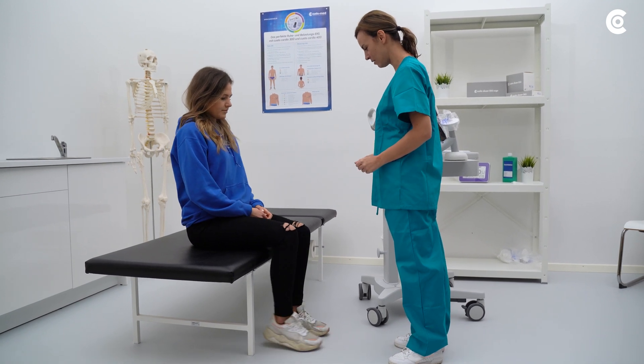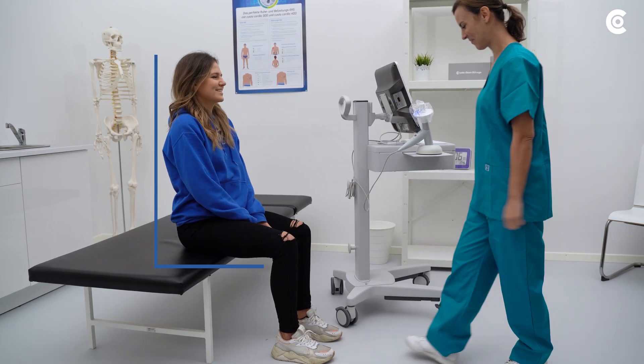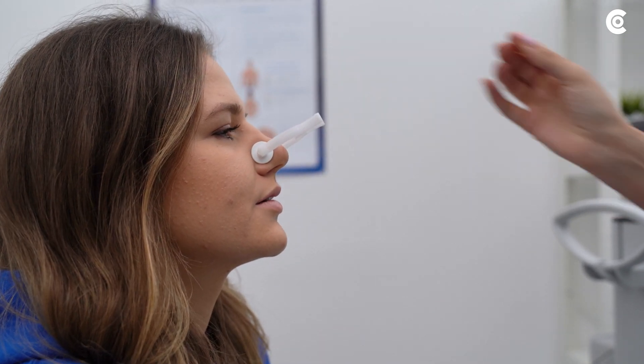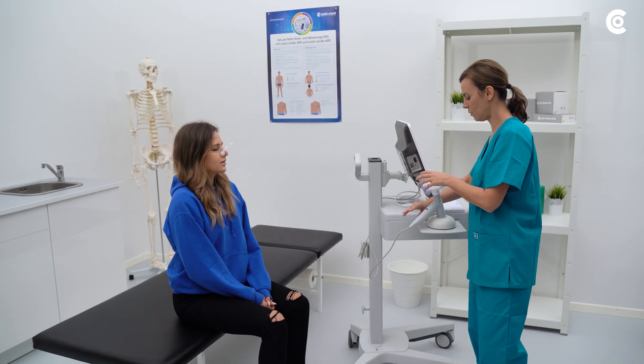You can now ask the patient to take the required position for the measurement. Make sure that the patient sits upright in a straight posture. Attach the nose clip and verify that no breathing air can escape via the patient's nose.